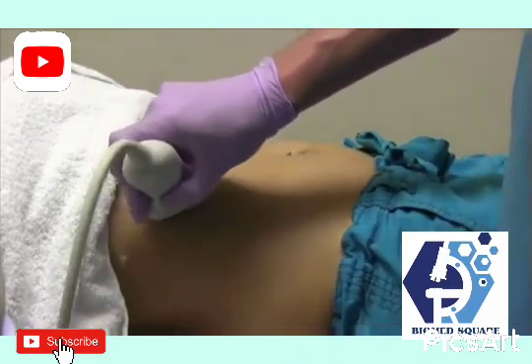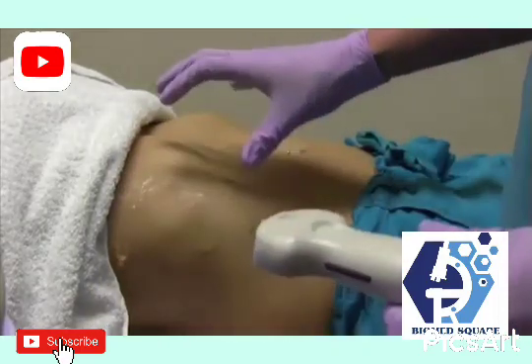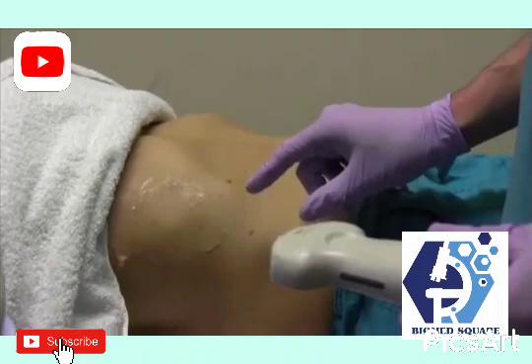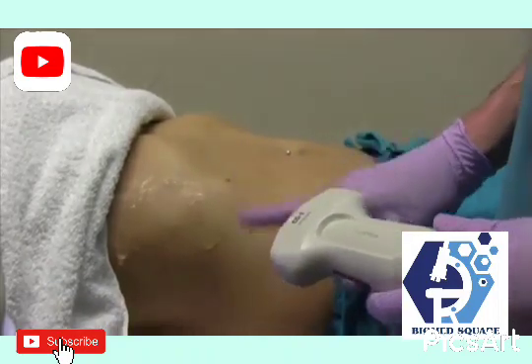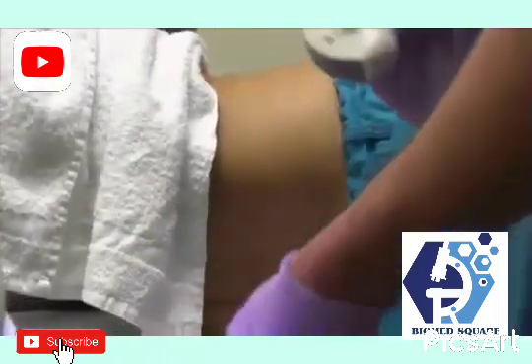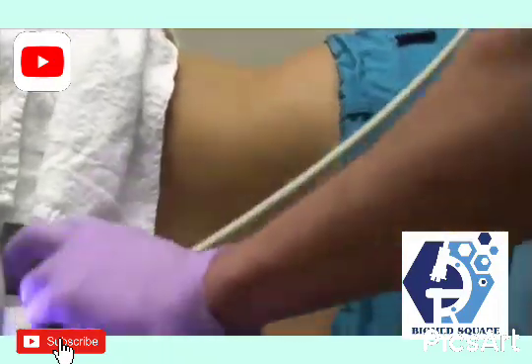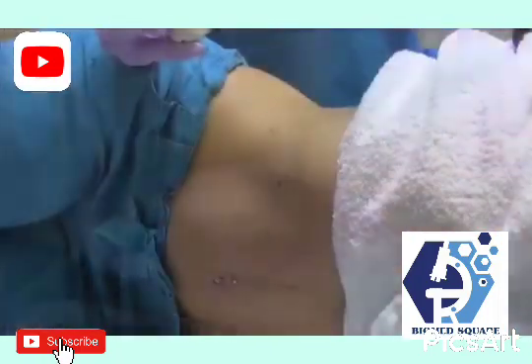For the gallbladder, we also get decube pictures just to make sure there's no stones trapped in the fundus, in the neck of the gallbladder. So for that, I'm going to have you turn onto your left side away from us. And for this, the gallbladder usually moves a little bit forward.